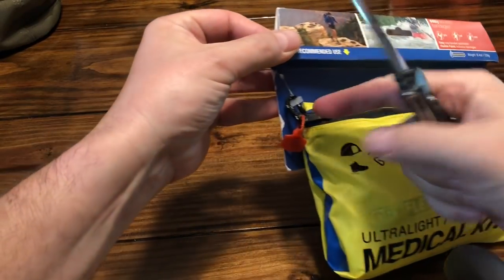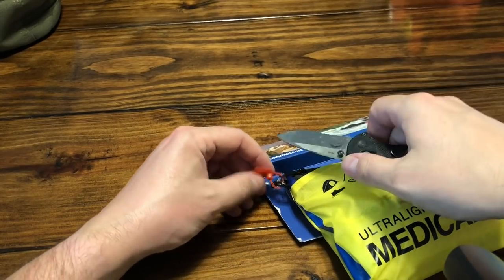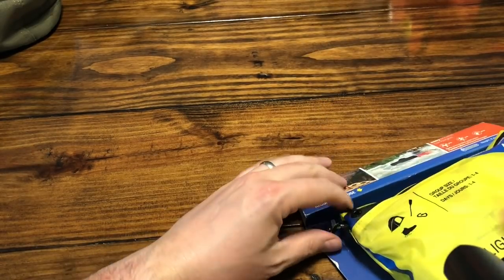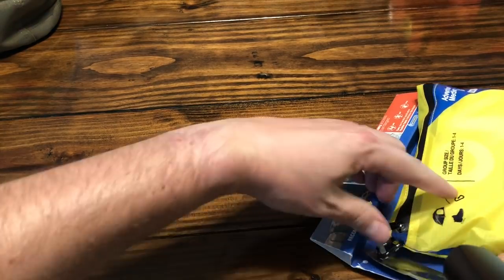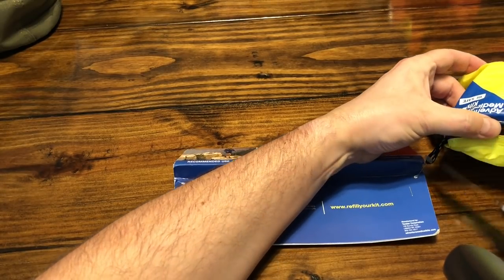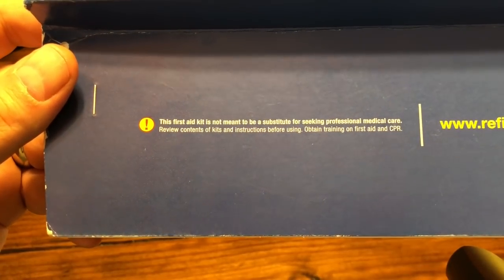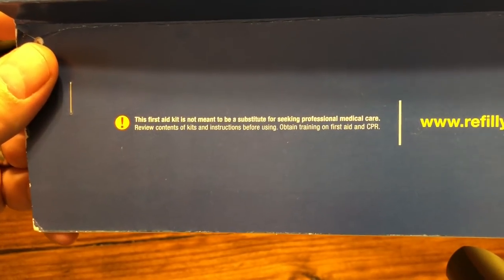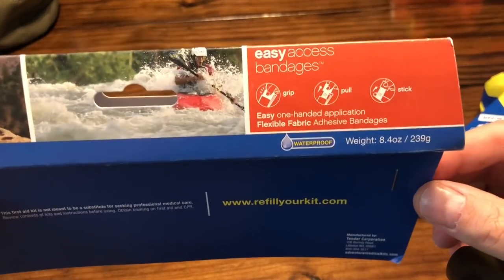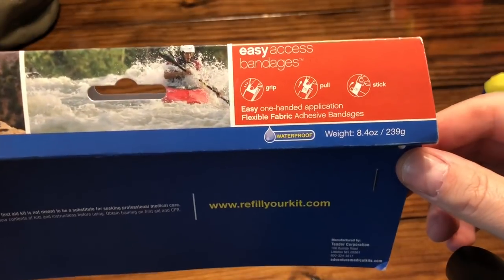I've been holding on to this kit and have not opened it - it's been zip-tied. Finally opened, taking the packaging off. You can see the packaging is a little worn. There's also a refillmykit.com reference on the package. It says this kit is not meant to substitute seeking professional medical care, to review contents before using, and to obtain training on first aid and CPR - which is a good recommendation for this video as well. This is just a review of what's in the bag.